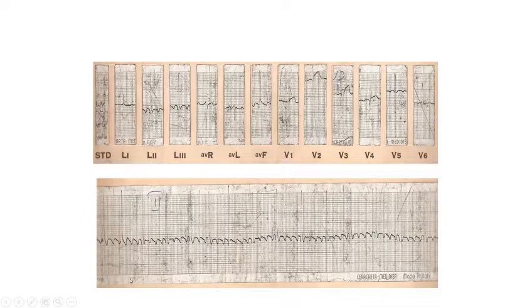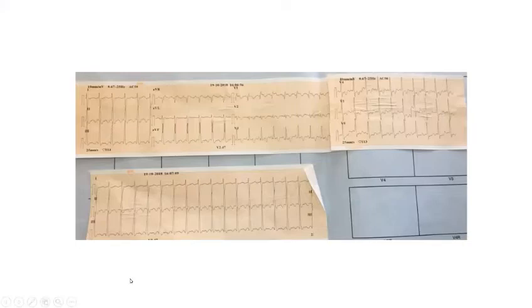Okay, right. We'll go to the next one. Sir, this is a 12-lead standard ECG, which is showing sinus tachycardia with a short PR interval of, I think, less than 120. And there are delta waves in the ascending limb in 2, 3 and AVF, sir. I'm not sure, but there is some evidence of pre-excitation, as well as in V1 there is a QR complex. There is evidence of RV strain patterns.